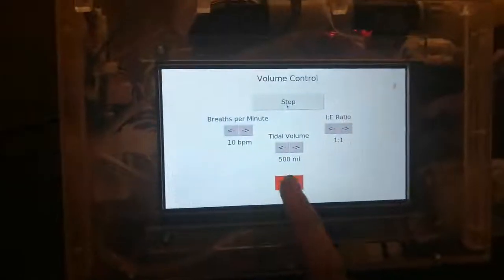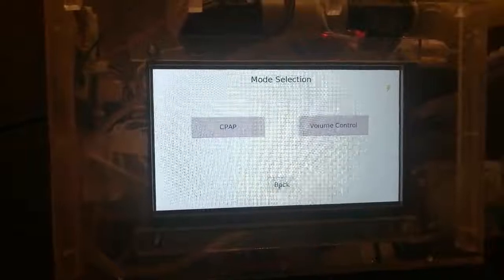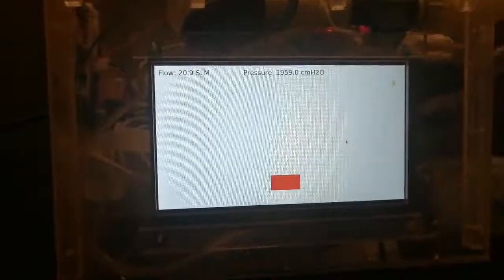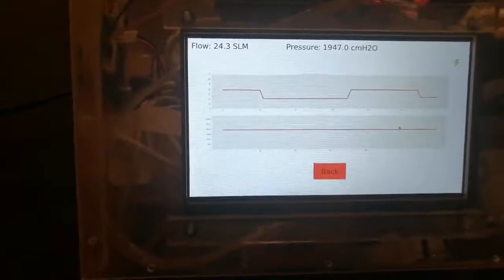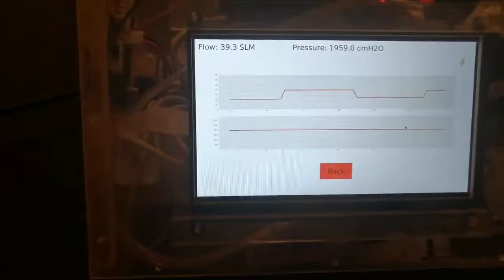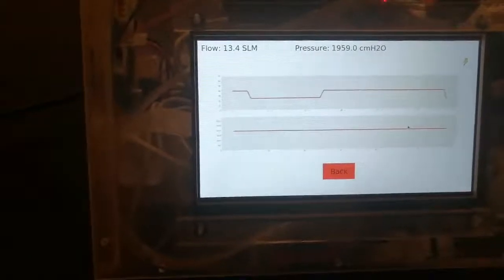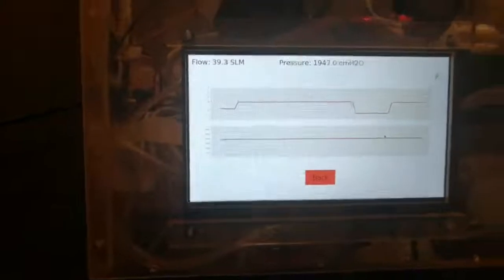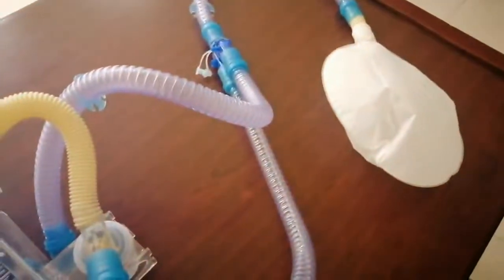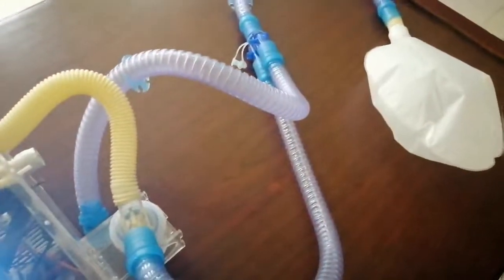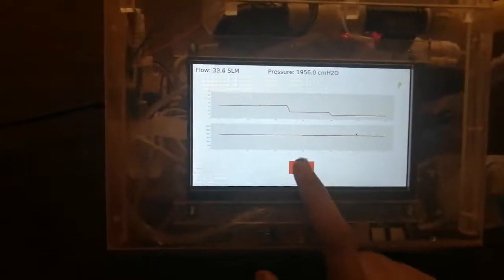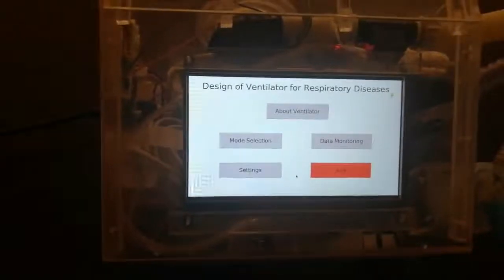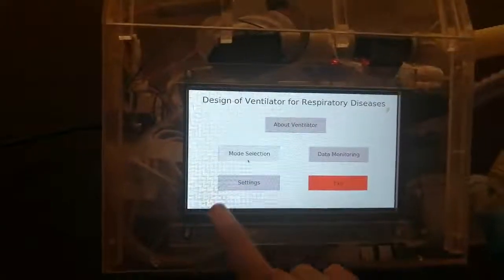You can also visualize this data on the graphical interface in the data monitoring section. These are the graphs of the variations in pressure and their parameters. You can go back and stop the application by pressing the exit button.